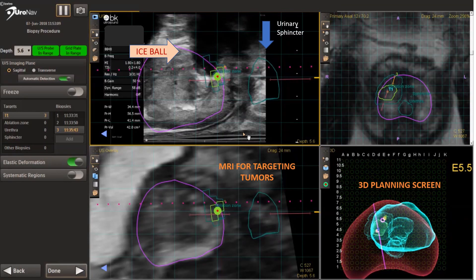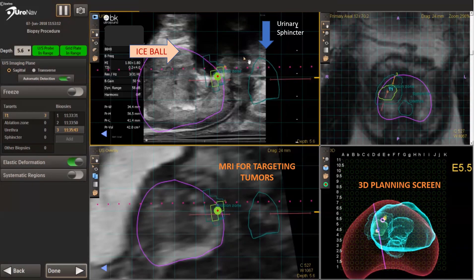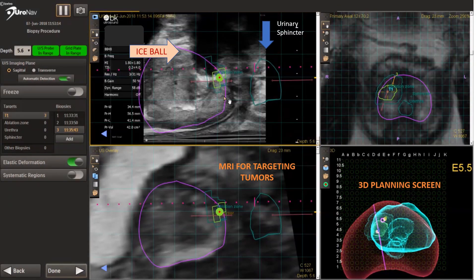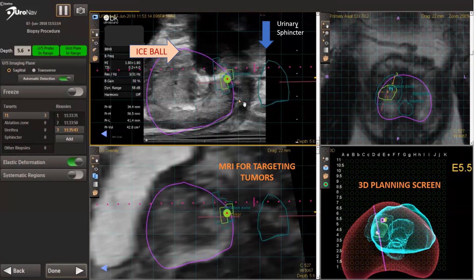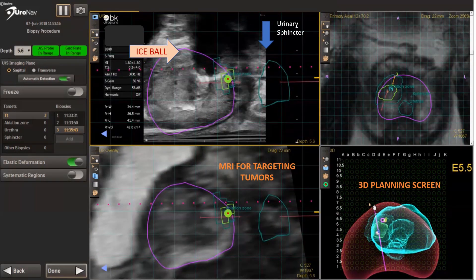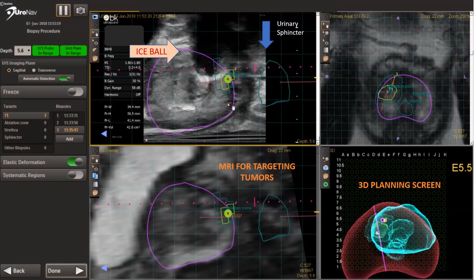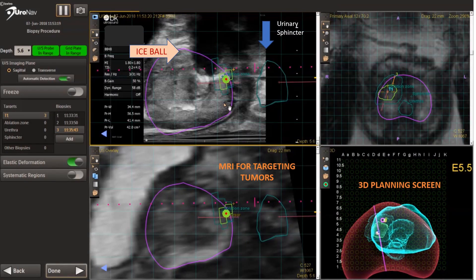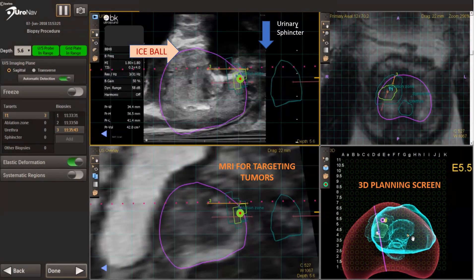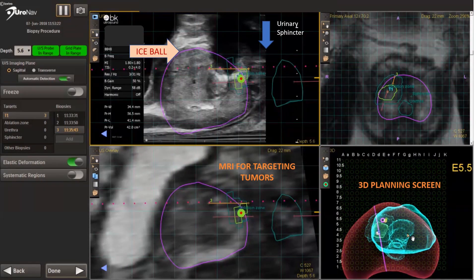The orange arrow is pointing to the ice ball that does propagate during the procedure. We do make slight adjustments, as you see here, to realign the MR imaging with the live ultrasound, which we're observing the case.